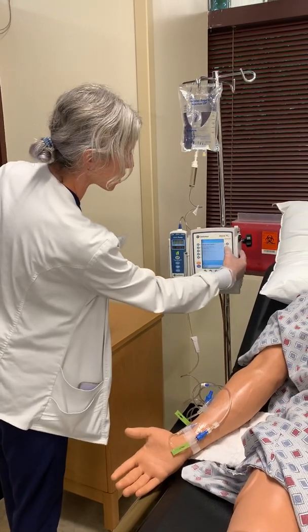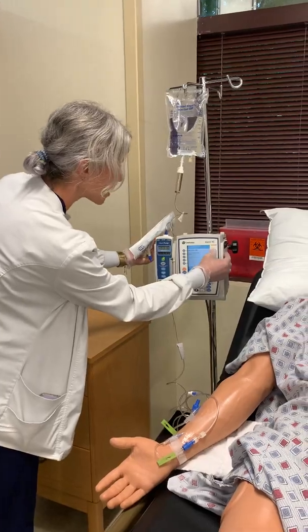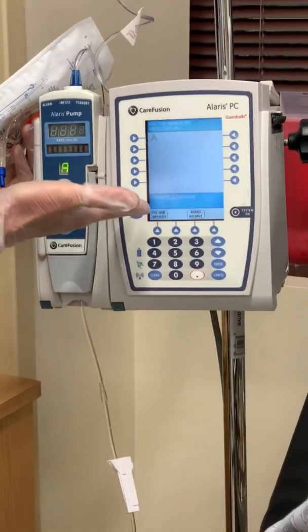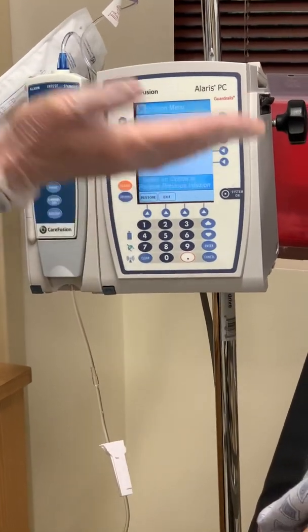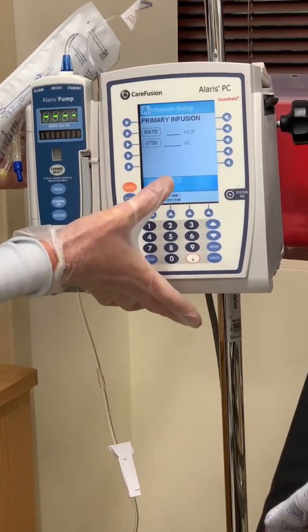Is he a new patient? We're going to say no, because he's not a new patient. Are we oncology? Yes, we are. Now, once again, guys, this is your hub over here. So this thing is beautiful. It talks to you. Select your channel. So we're going to come over to channel select, and we're going to go back so you guys can see this once again really quick. So we're doing a basic infusion.